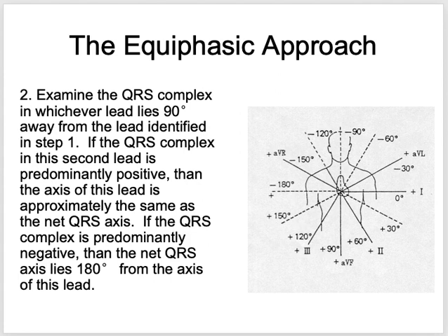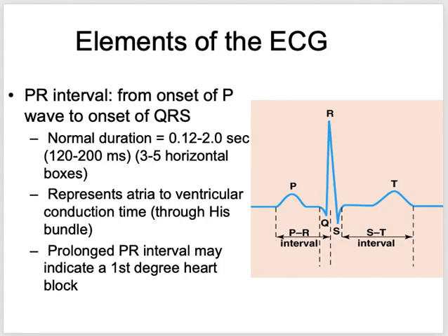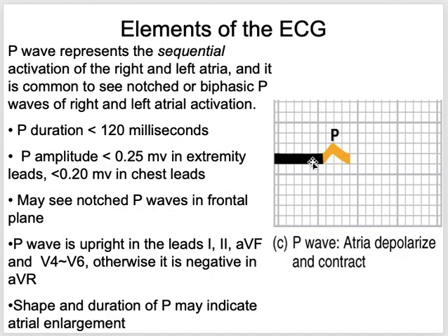Now the abnormalities of the P waves. All this discussion started from the P wave, by the way. What we were discussing is the P wave. If I show you again that photograph, the normal duration of, oh, this is PR interval, sorry, P wave. Whenever we check the P wave, we check how tall it is, how long it is, and we look at the shape.